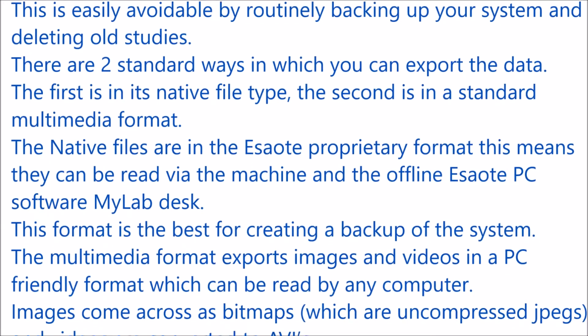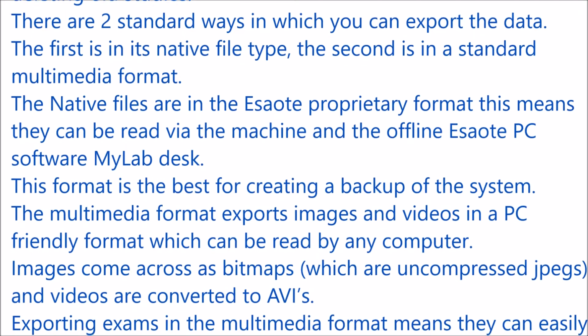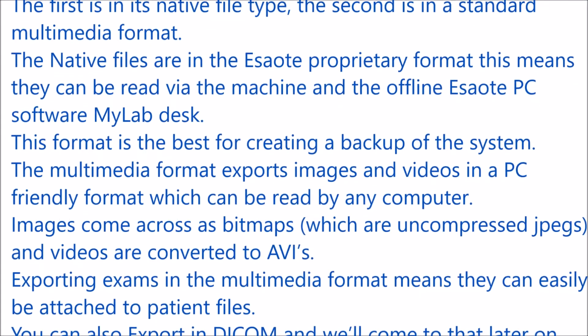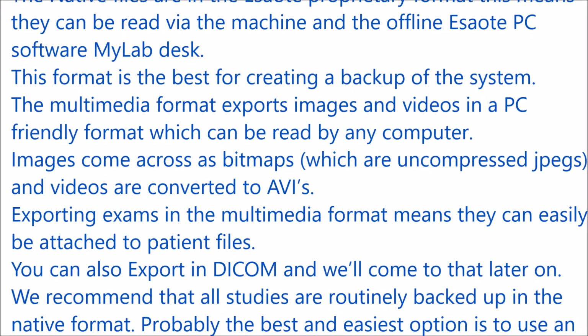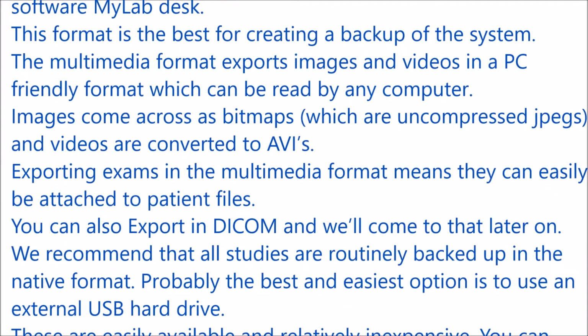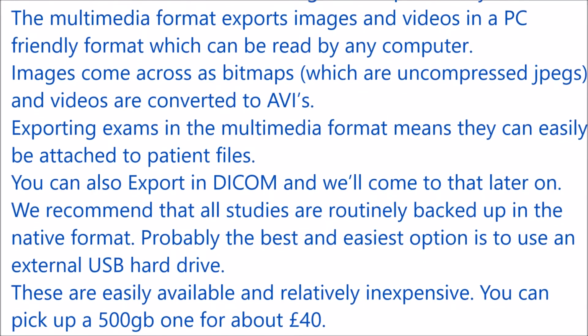The multimedia format exports images and videos in a PC-friendly format, which can be read by any computer. Images come across as bitmaps, which are essentially uncompressed JPEGs, and the videos are converted to AVIs. Exporting exams in the multimedia format means they can be easily attached to patient files on your computer. You can also export in DICOM, but we'll come on to that later on.